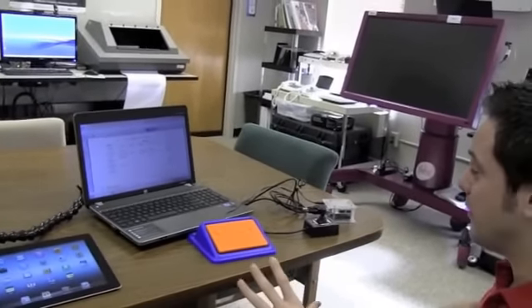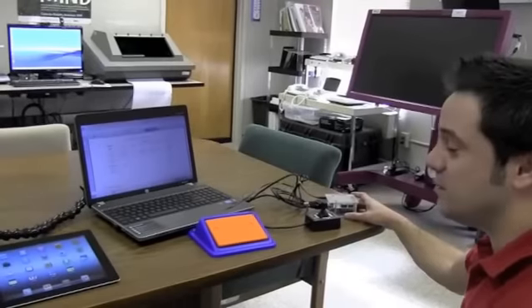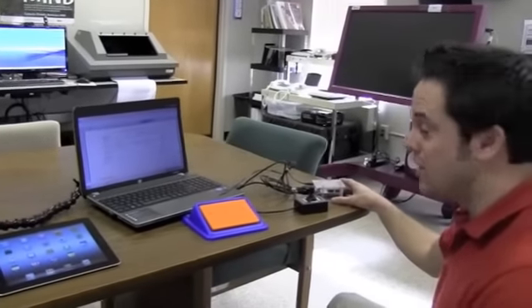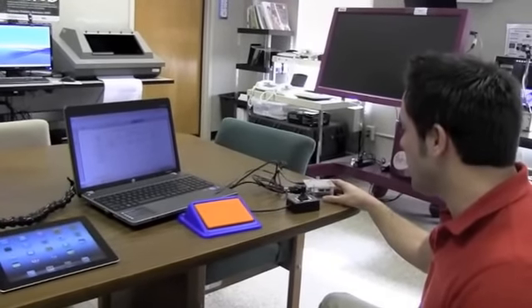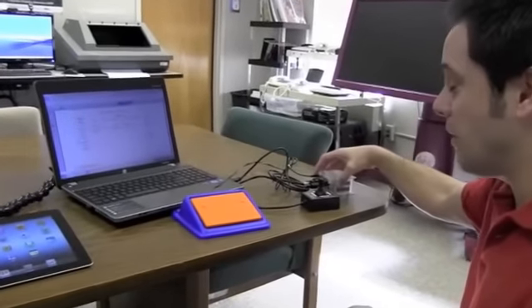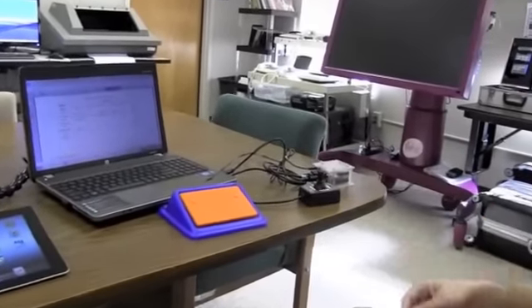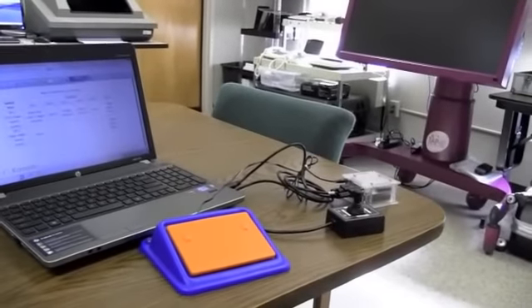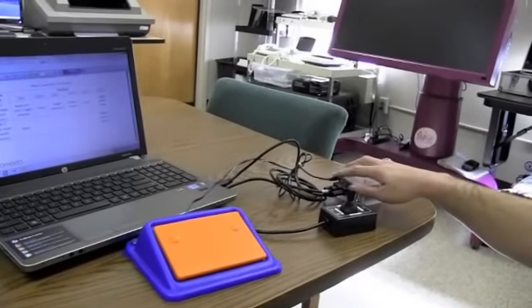The device itself, the Tecla Shield, needs to be powered through a USB cable. That's why it's hooked up to my computer. Our switch is hooked into one of the ports there. There is a secondary port for two switches like I said, but right now we're just going to use one.